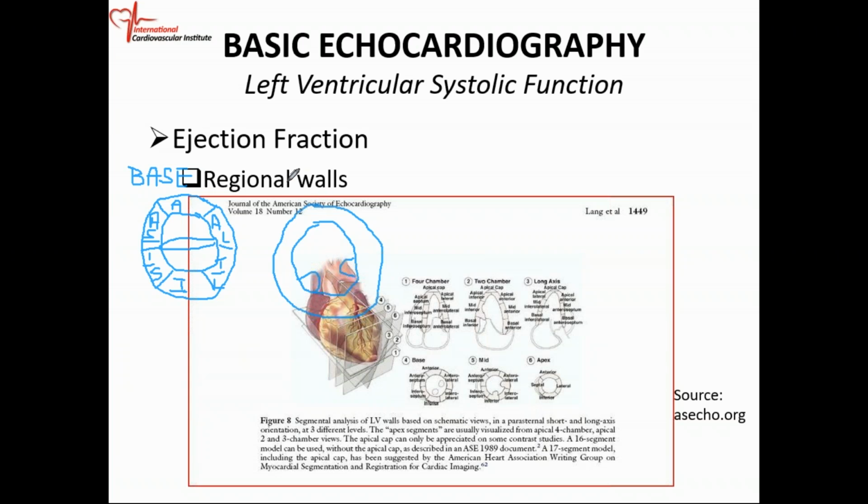You can write mid. We're going to divide the mid segment also into 6 segments. And the beauty about that is the mid segments have the same names as the segments at the base. It is named the same way.